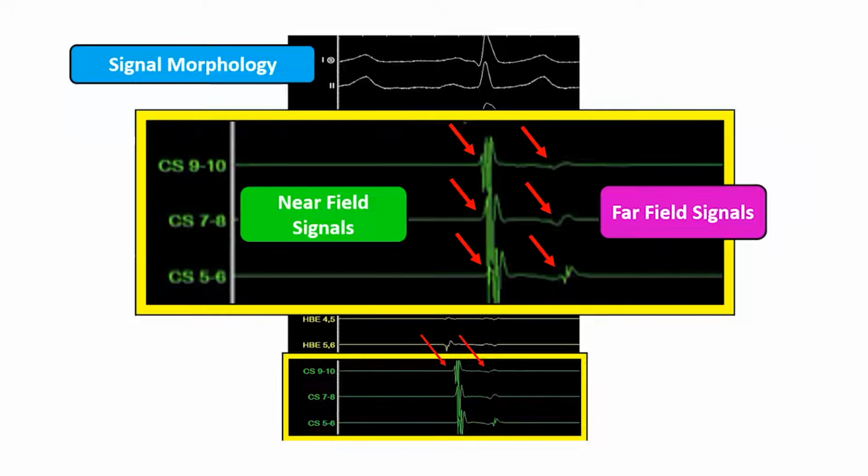annulus. So it's capable of recording local atrial signals, but still close enough to the ventricle to see distant ventricular activation. So here we can see what the catheter is looking at. Local atrial activation followed by remote ventricular activation after that wavefront makes it through the His-Purkinje system and we have ventricular activation.